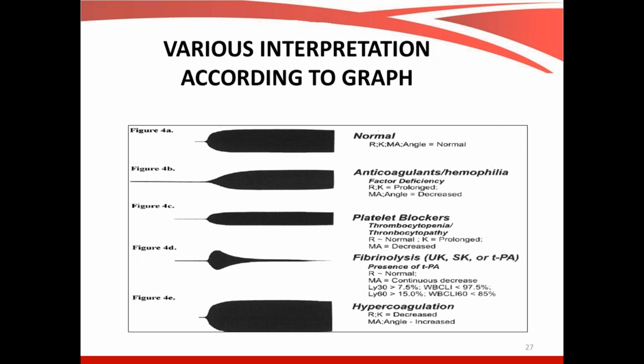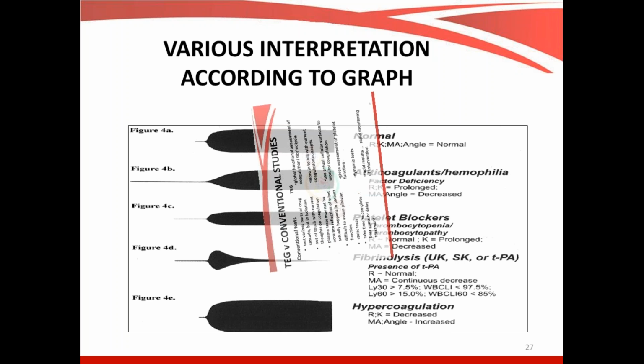This will be the picture most commonly seen. And if you continue on ECMO and ECMO is not helping the patient much, this is the picture you will see. So when you have your patient coming in on ECMO, remember these two figures. These are the most common figures. If you have this figure, it means it is ready to be weaned off ECMO. Okay, so those are the 3 figures there.